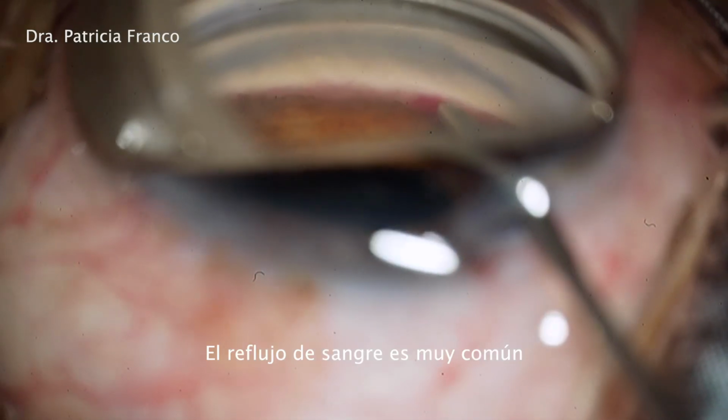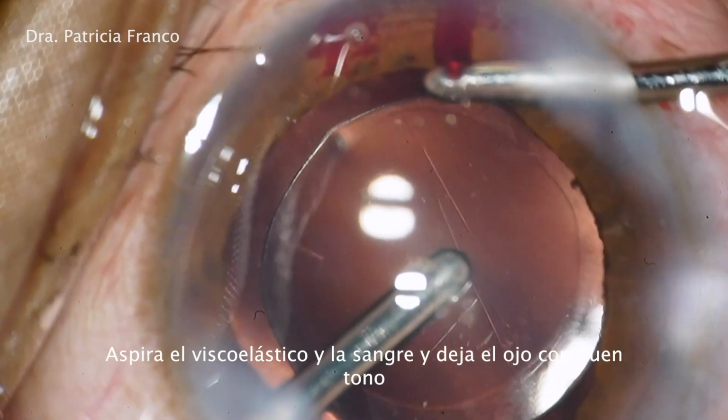Heme reflux is very common. Aspirate and finish the case.